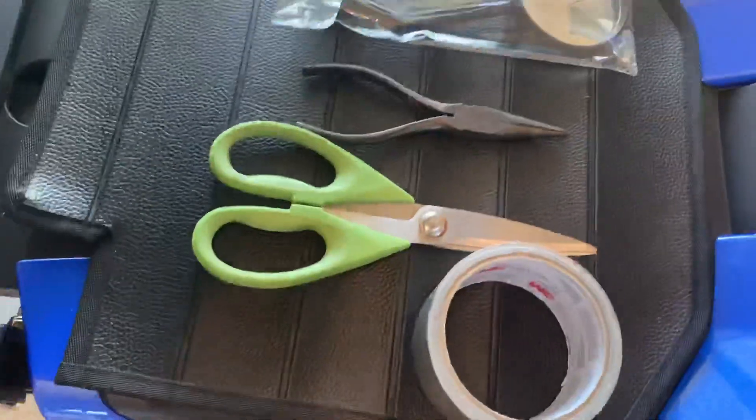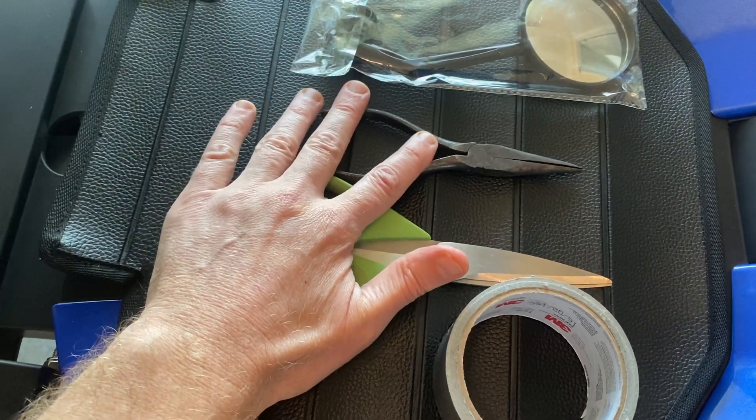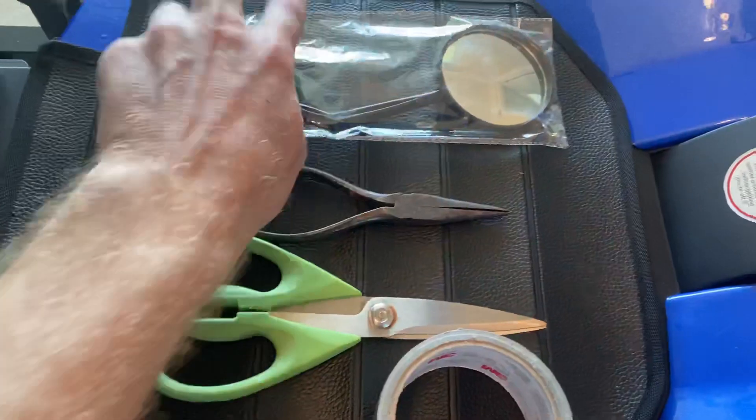Okay, so that is all set. We're going to take a look at basically the materials needed here. I have some needle-nose pliers to make things nice and snug, a little bit of duct tape, and I have a mirror.